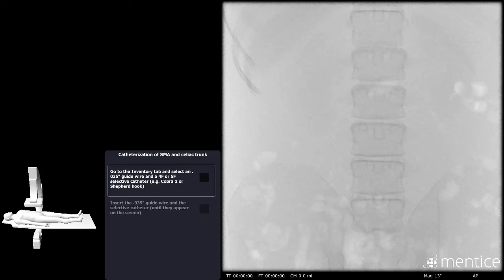What I would say to you is that a lesion of this size would normally now be treated with ablation. So for simulation purposes, let's say that this mass is 5 centimeters within the right lobe of liver, and that will be the premise. So once you have reviewed your pre-procedural imaging and you understand, number one, where the lesion is, it's very important to do your pre-procedural planning.